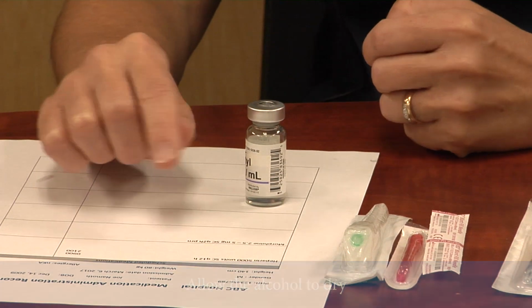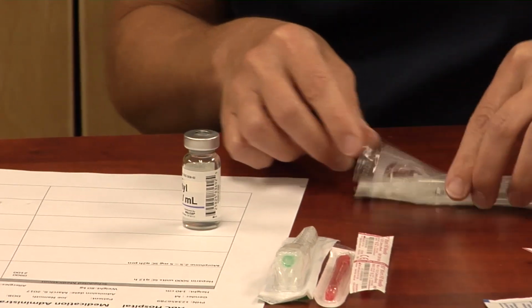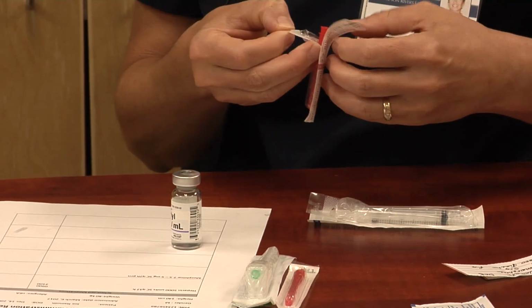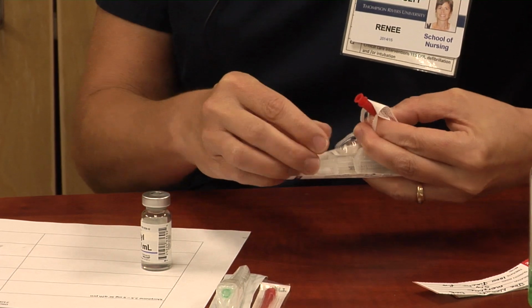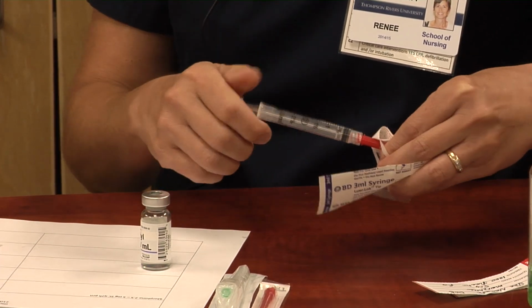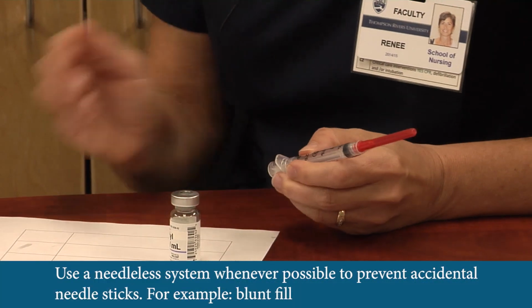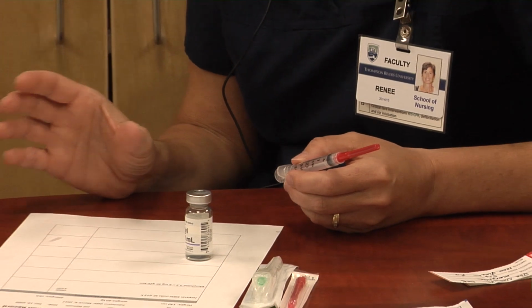I've checked my MAR. I know the volume that I have to give, so I select my appropriate syringe. You try to select a syringe that is closest to the volume of medication that you need to administer. Is there any rule, like can you use any size of syringe, like a 10 cc syringe? Depending on your purpose, there are some procedures where you need the larger volume syringe because of the pounds per square inch that come out of there. We'll learn about that when we learn about flushing central lines.